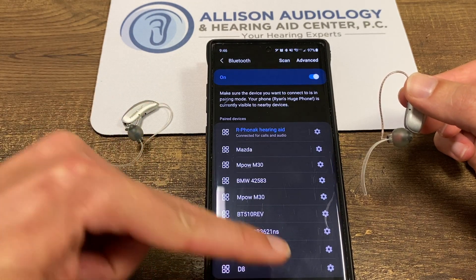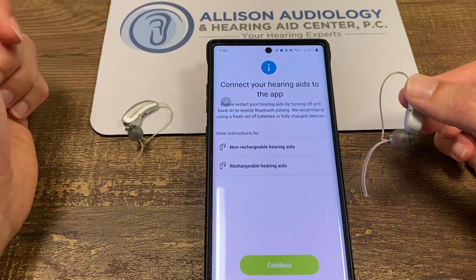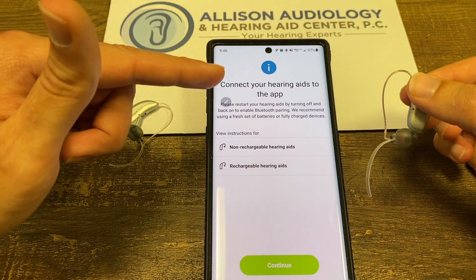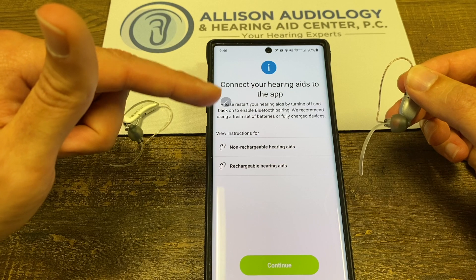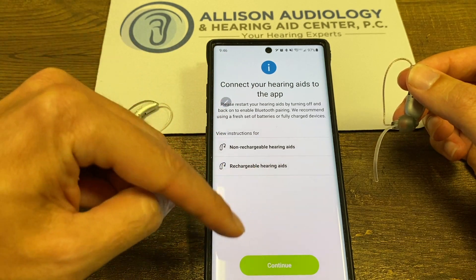So now we'll back out and go back to the My Phonak app. If you just downloaded the app, it's going to ask for a whole bunch of permissions. When you get to that screen, you're going to press continue.